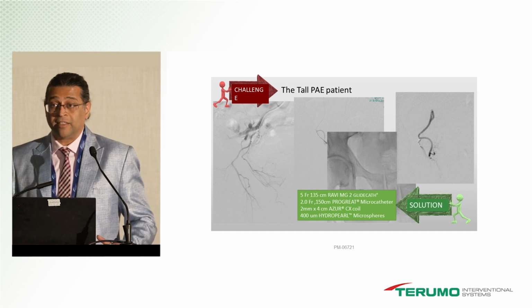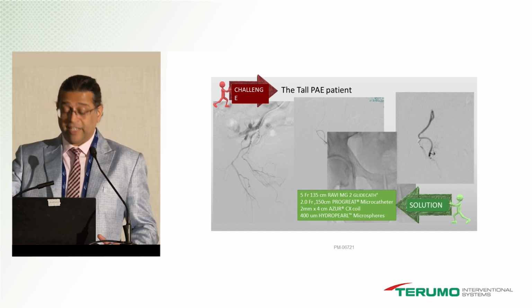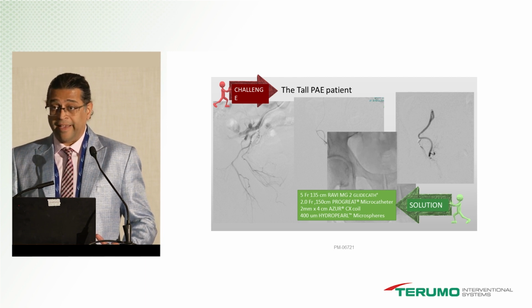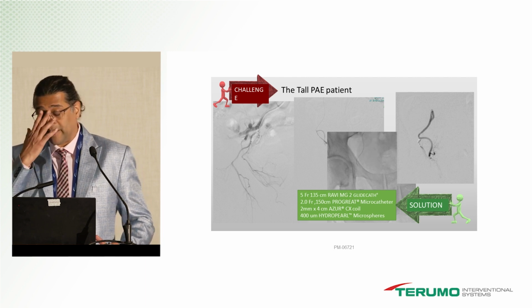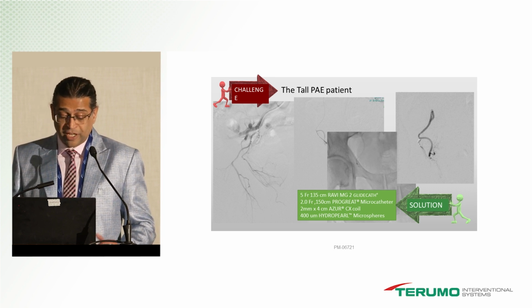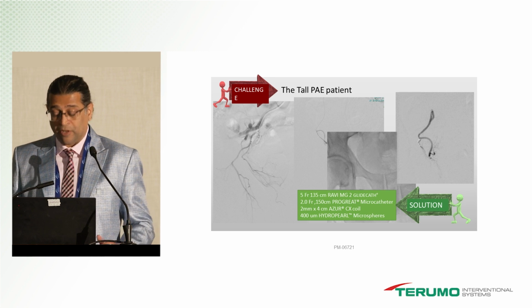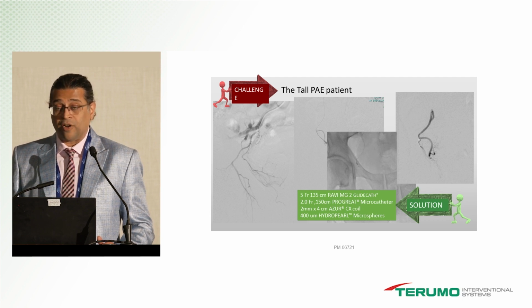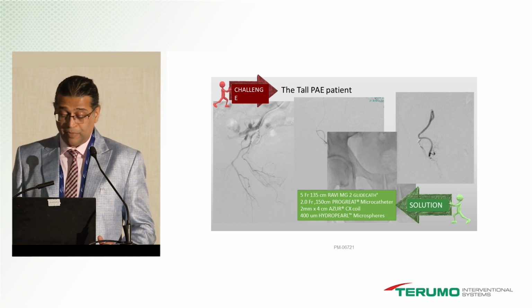So now if you're going to put particles there, you can either go into the prostatic artery selectively, which is going to be a challenge because there's a lot of curves there, and it can cause spasm. A prostatic artery and uterine artery are not the same. A prostatic artery causes spasm right away. So you can go down there and cause spasm, but what I chose to do was go down there and put the CX coil, which is coming down now. So the CX coil went down there. I did protective coil embolization of the accessory pudendal artery.